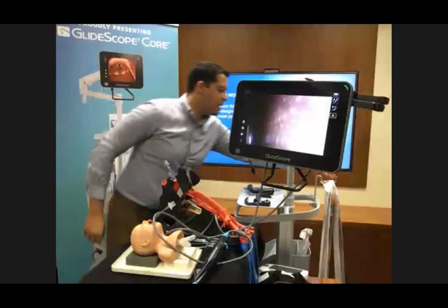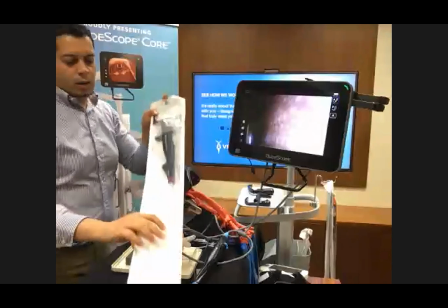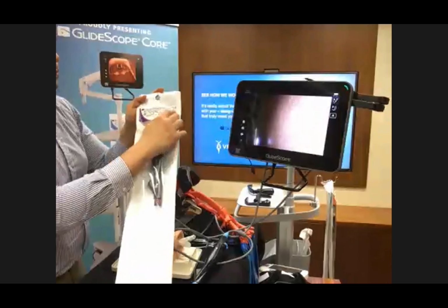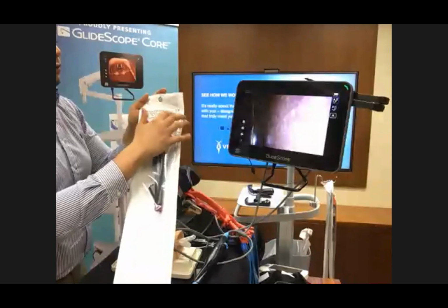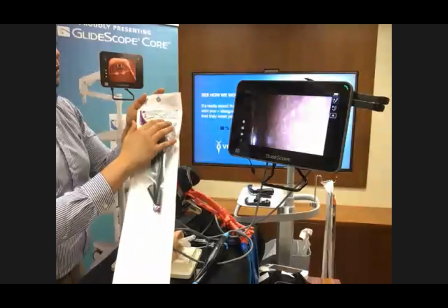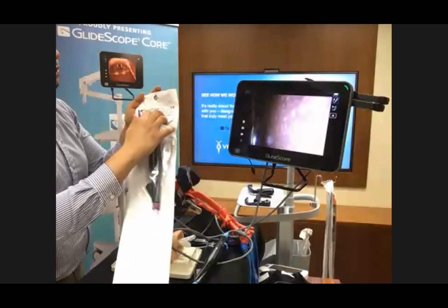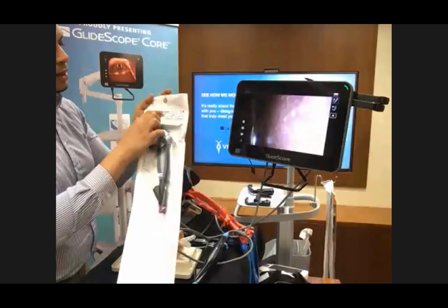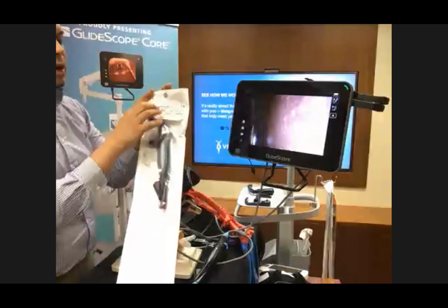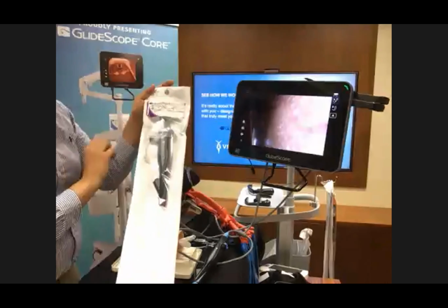The good thing I want to mention here is that we have a label on the bronchoscope, where we have 3.8, where you can connect an ET tube of size 5 and above. You might also have the 35 French tube connected, in addition to the accessories where you have the forceps and the brush, which you can connect at below 1 millimeter.